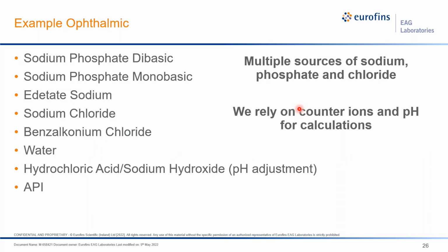So finally, we're going to get into an example of ophthalmics. And these are some of the most fun formulations, and not just because they're 99% water and we're almost done. They're really fun because when we look at these formulations, there are so many moving parts and so many things that just everything seems to have a counter ion that matches something else. So it's fun because it's tough.